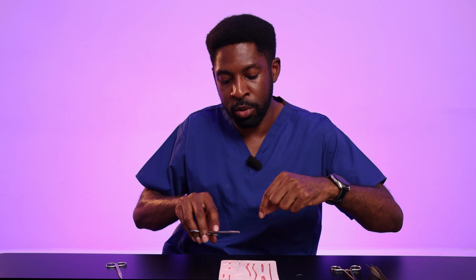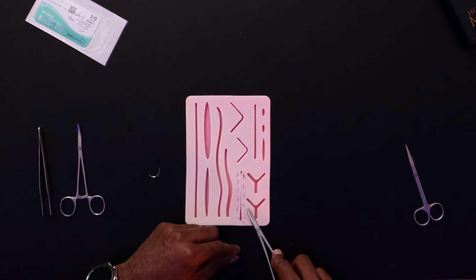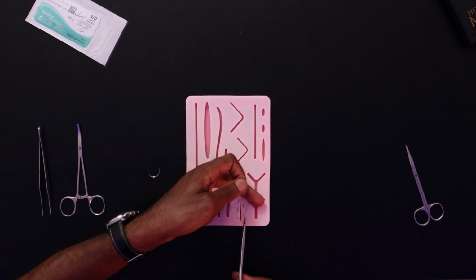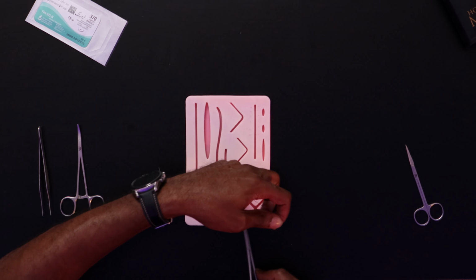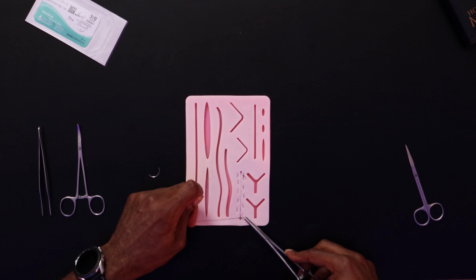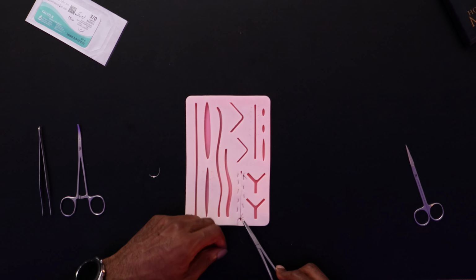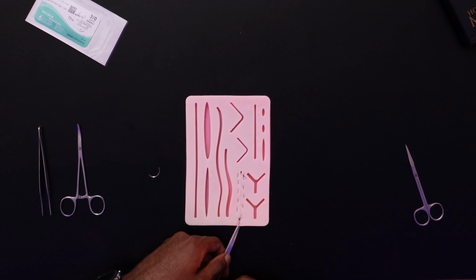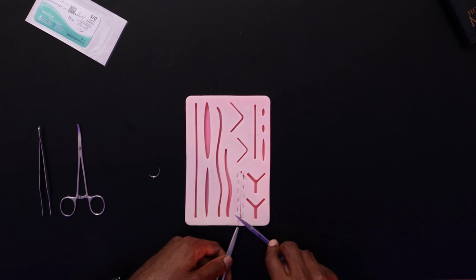And just as we've done before, two throws, another throw in the opposite direction, and one more in the original direction. And there, cut your thread at the end.